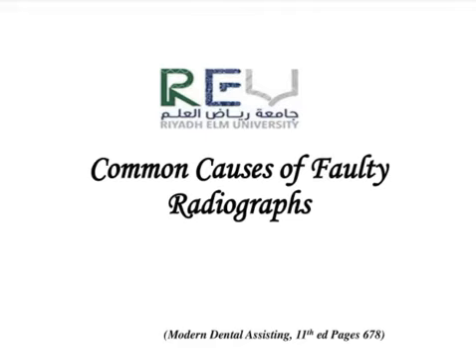Whereas if it's shallow, there needs to be alteration in the techniques as you do in the lab. Sometimes you need to increase the vertical angulation. At that time, it can end up in projection errors like cone cuts, incomplete coverage, all these things. So all these errors which occur because of adjustment of the cone and the X-ray beam are called projection errors. Okay, we also have processing errors.